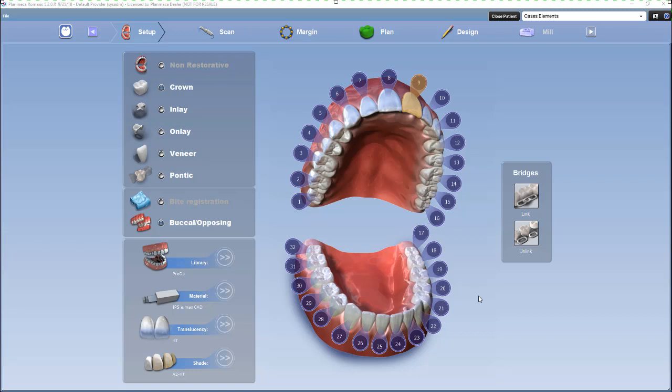When doing a contralateral from an existing tooth, in the setup tab, you'll set up everything like normal. The only difference would be the library — and the library you want to choose is pre-op.